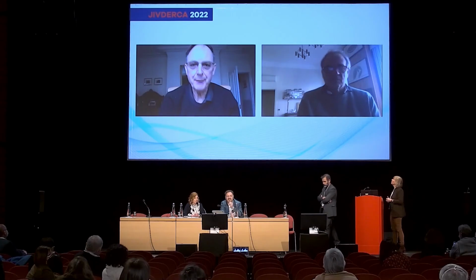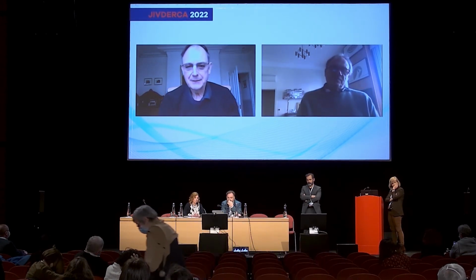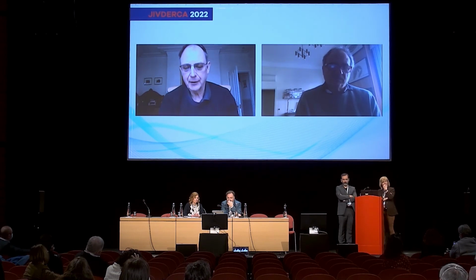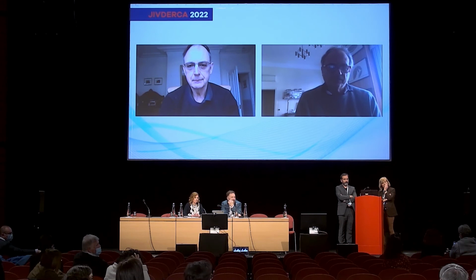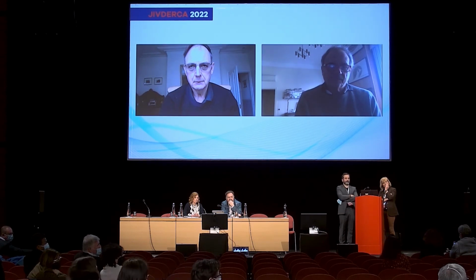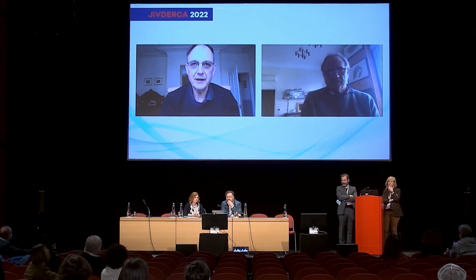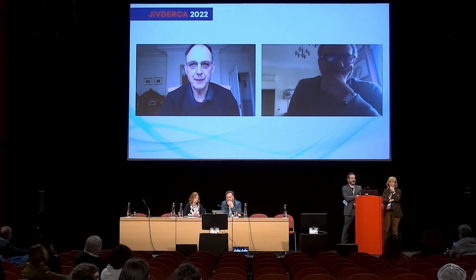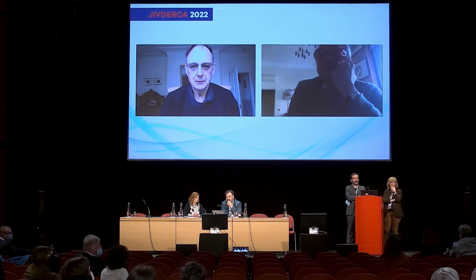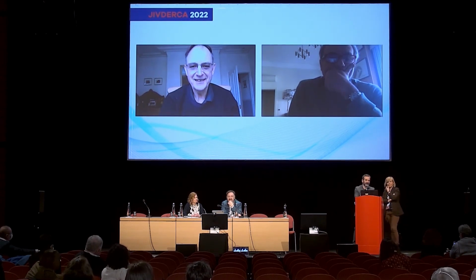Can I come in? My understanding was that you were basically flushing the CO2 out of the anatomical dead space, so that you reduce CO2 rebreathing effectively. You're replacing CO2 in the anatomical dead space with air. In the anatomical dead space, the levels are so low that they do not contribute to the PaCO2. So even washing out... When you're breathing out, in the exhaled gas, that may not be true, because ultimately it's all going out that way. That's how CO2 comes out of the body. The end-tidal CO2 is lower than the arterial CO2. Indeed, you see that we still have physiological questions.